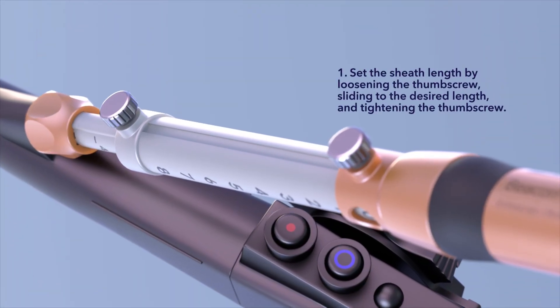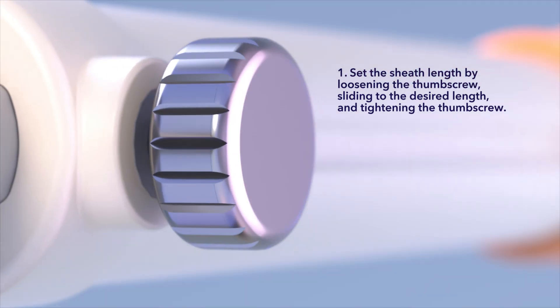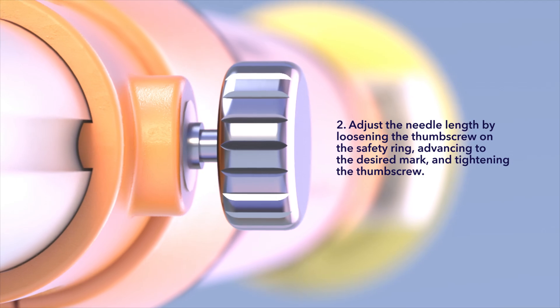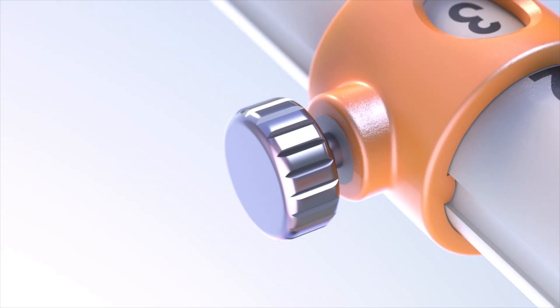Set the sheath length by loosening the thumb screw, sliding to the desired length, and tightening the thumb screw. Adjust the needle length by loosening the thumb screw on the safety ring, advancing to the desired mark, and tightening the thumb screw.